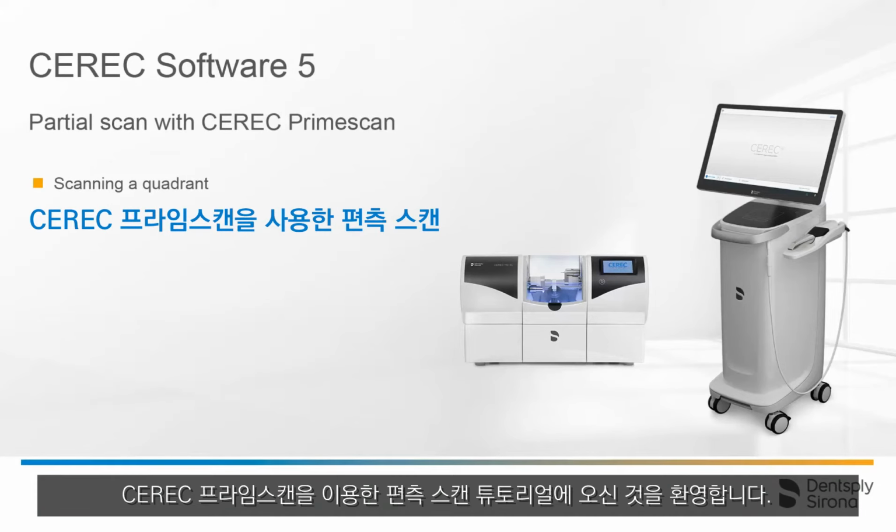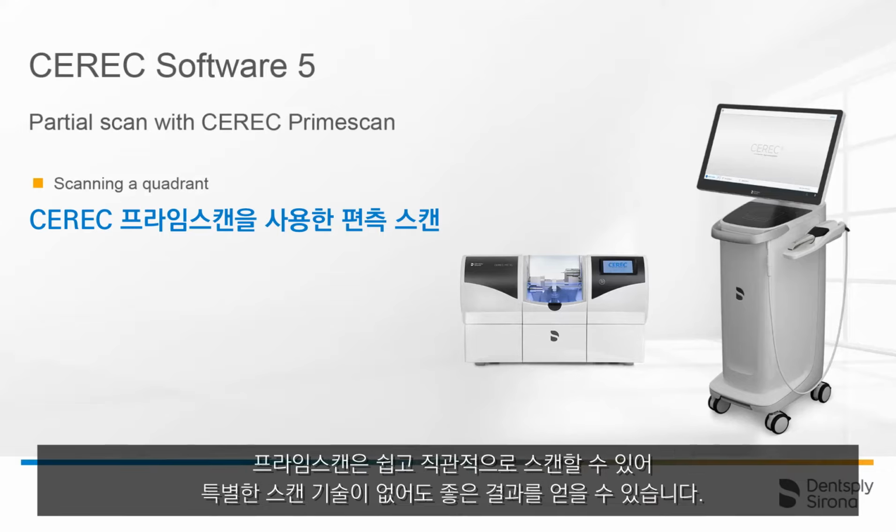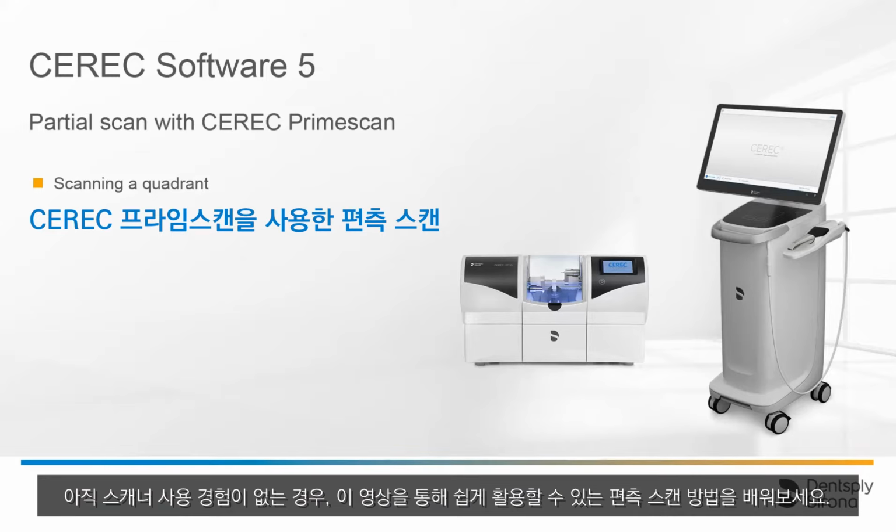Welcome to this video tutorial on the topic of partial scan with Cerec PrimeScan. With PrimeScan, scanning is easy and straightforward. Without any special scan strategy, very good results can be achieved. If you don't have a preferred scan workflow yet, this is a scan strategy for a partial scan that is easy to learn and works well.